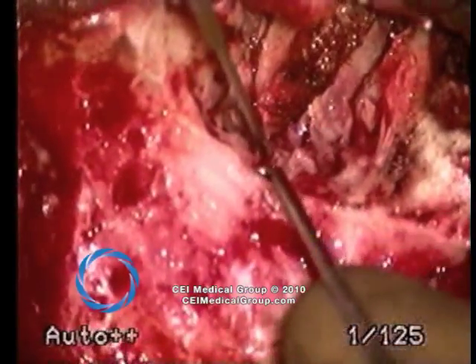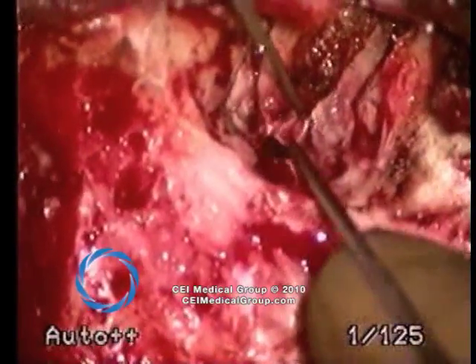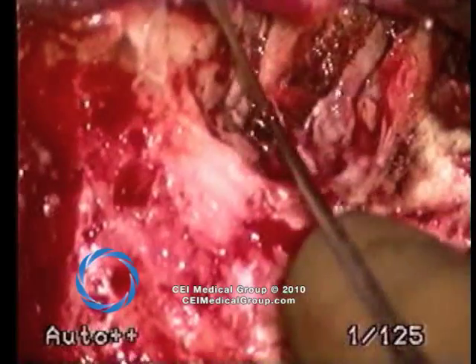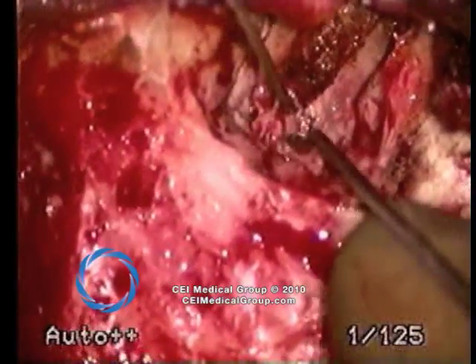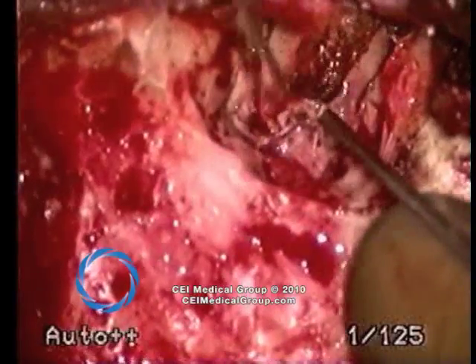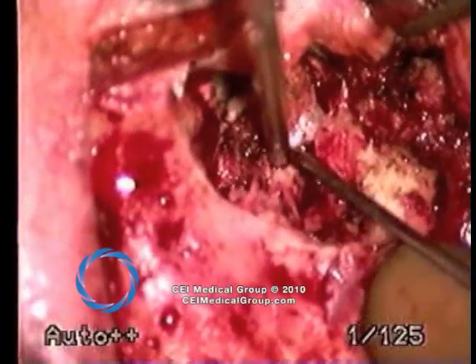Several steps which will be outlined will aid in reducing the chance that epithelium is left in place. In the example we are presenting, the mastoid bowl contains multiple spicules with invaginated bone. Most cases are not of this difficulty.